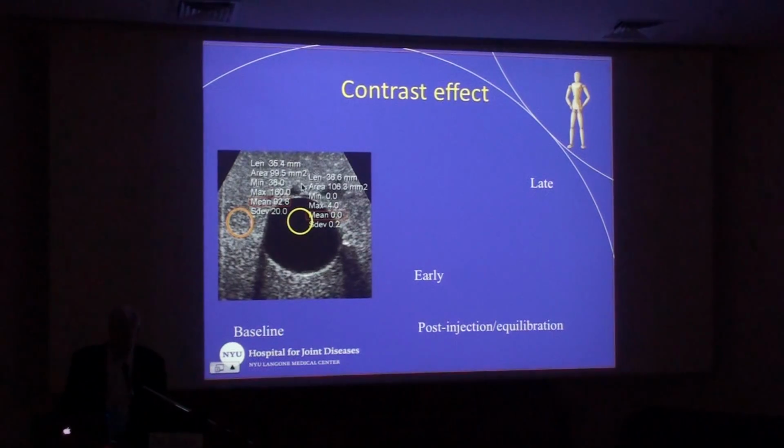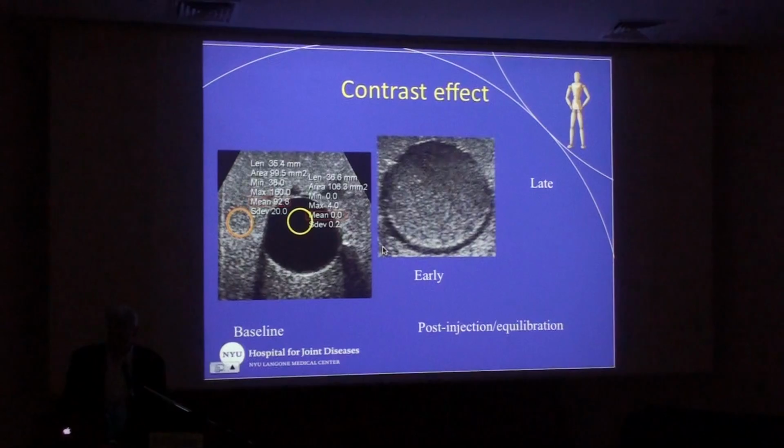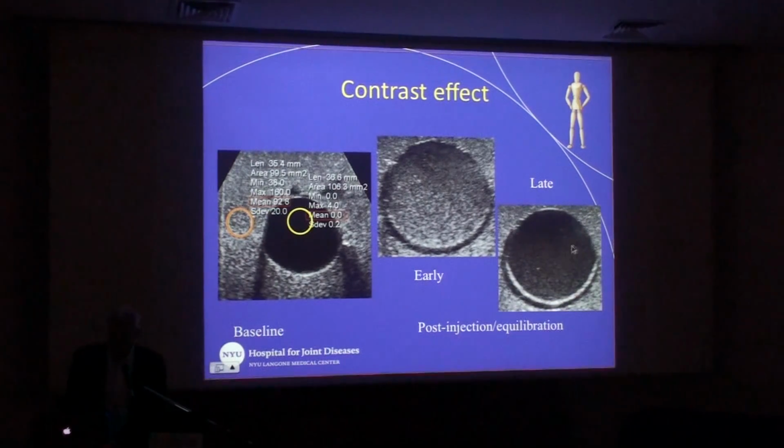So this is a tissue mimicking phantom with a cyst within it that's completely anechoic. And when you inject this material in there, you get a mixing phase where this stuff distributes fairly uniformly. And you can see the internal contrast just by virtue of doing the injection with the steroid mixture itself. And because this is particulate, you suspect it would settle over time gravitationally. And in fact, that's what we see. When we look at this later image over here, we can see that there's sort of drop out along the superficial part of the cyst and then some increase that goes towards the bottom.